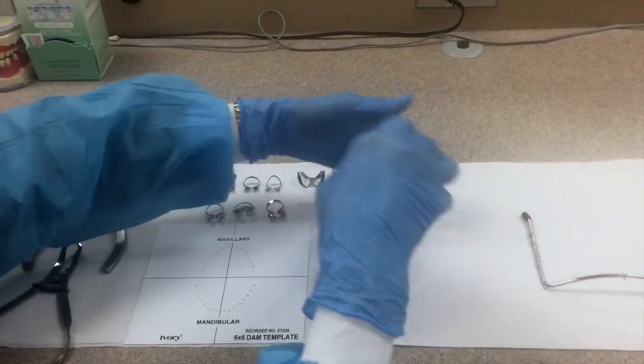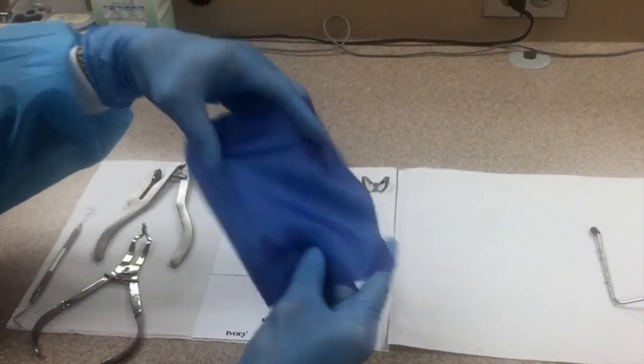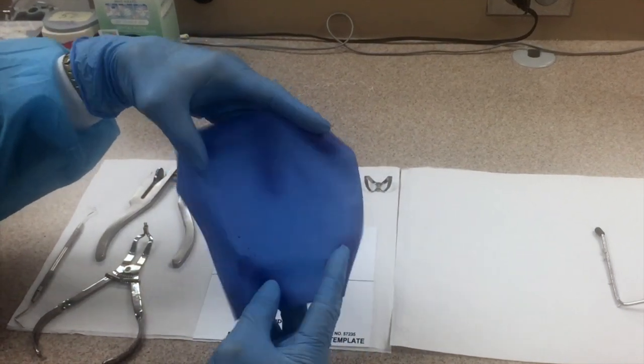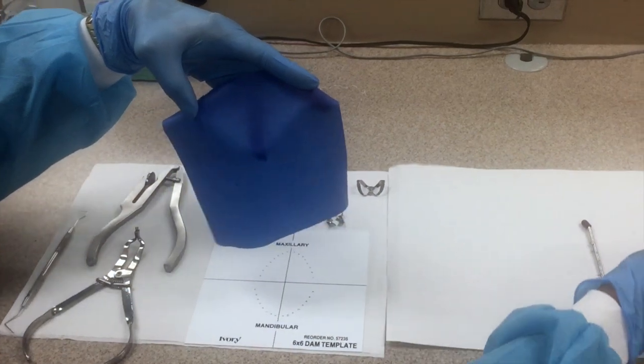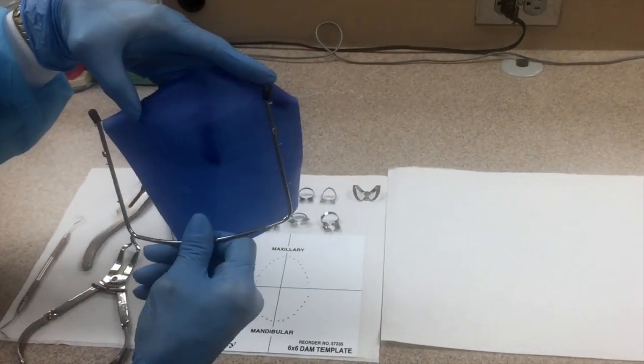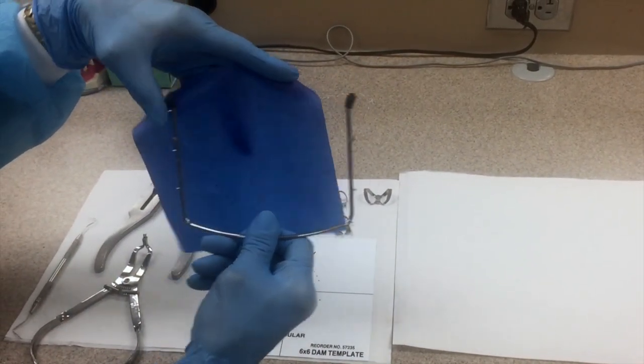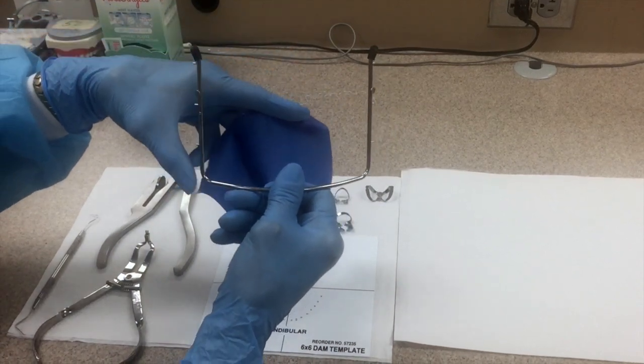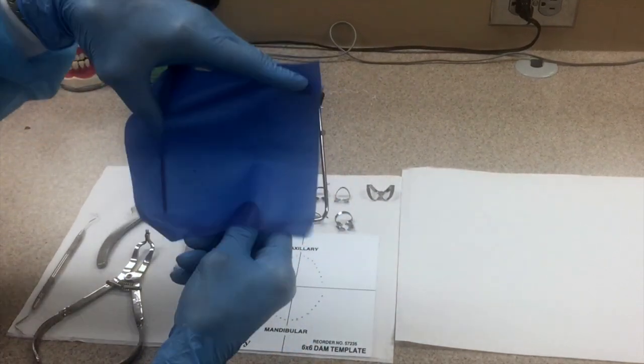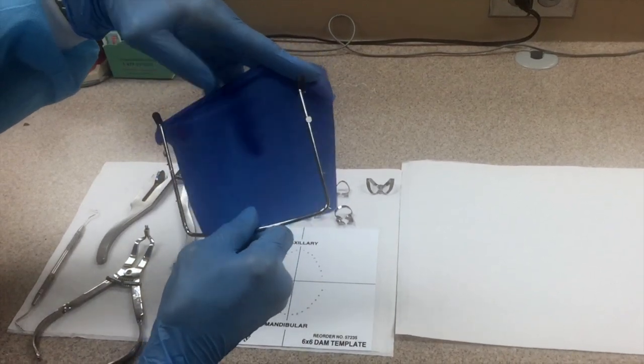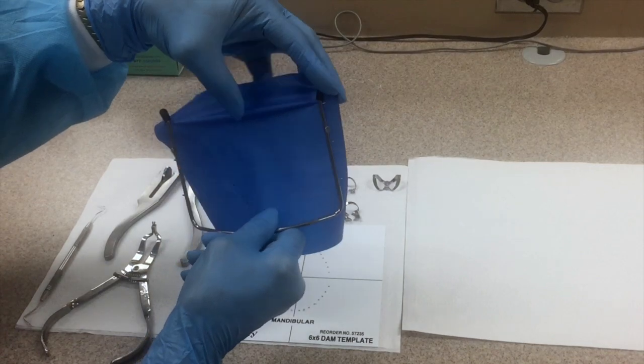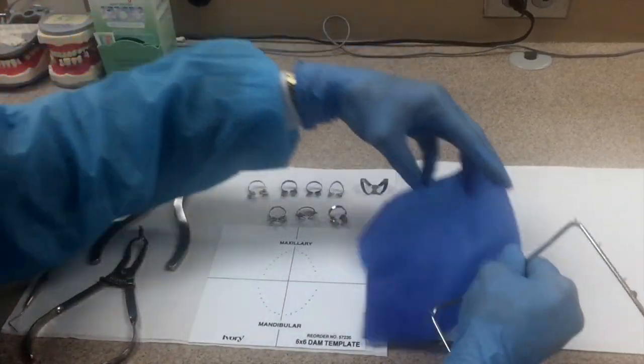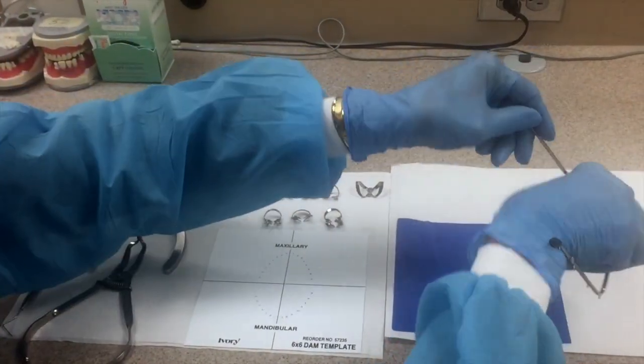This is our rubber dam and it is pretty floppy. In order for this rubber dam to not flop around the patient's mouth, we attach it to a frame. The frame, as you can see, has prongs on it. We attach these prongs to the rubber dam and that will stabilize our rubber dam on the patient's mouth.